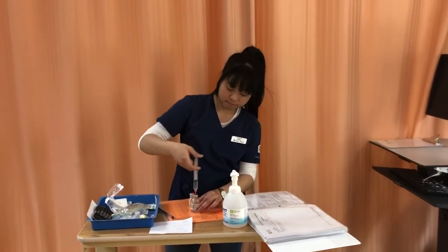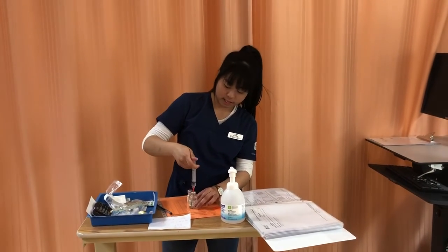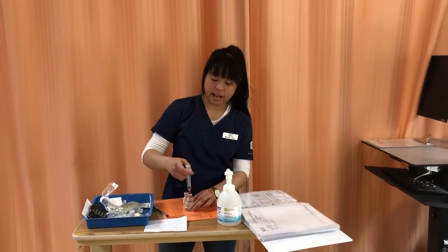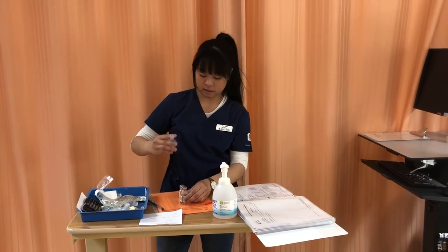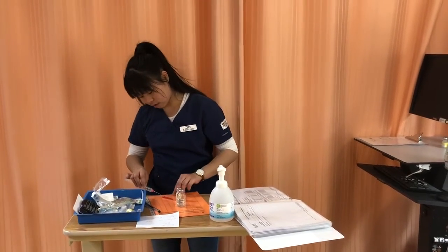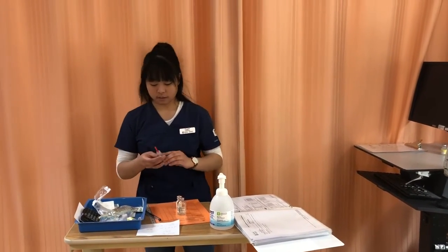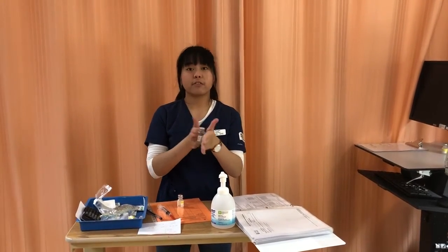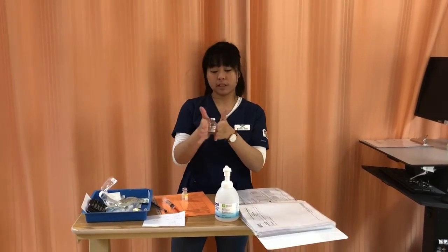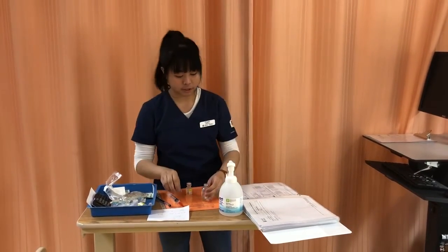20 ml per hour. And the volume I have is like 110 ml. And I'm gonna aspirate the excess air to maintain the pressure within the vial. So like so. And I'm just gonna do the scooping method. Okay, I'm just gonna push that back. And I'm gonna slowly roll my vial to make sure that everything is diluted or reconstituted. And so I don't see any clumps in there, everything is dissolved, so we're good to go.